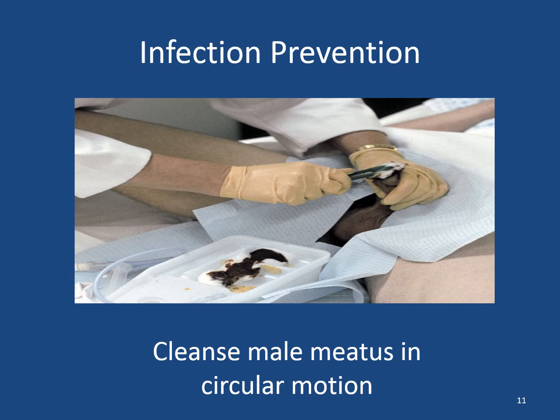And when we're cleaning it, we start at the meatus and work in a circular motion moving out. And you would want to use all the swabs that they have in the kit. Usually it's going to be 3 swabs. Sometimes you might have a kit that has about 5 swabs, so be mindful of that.